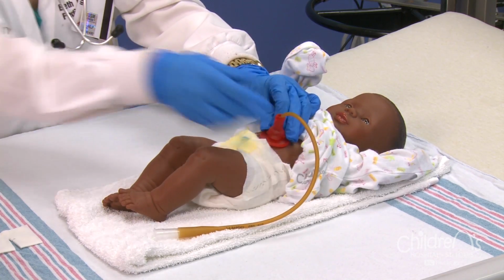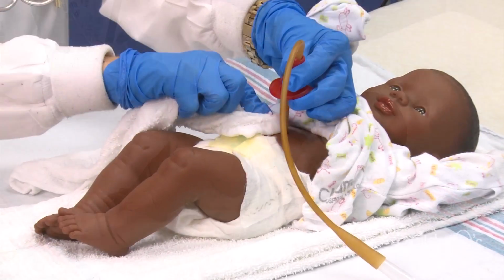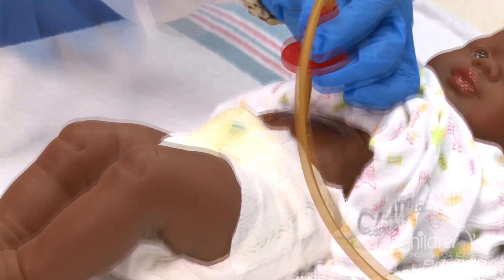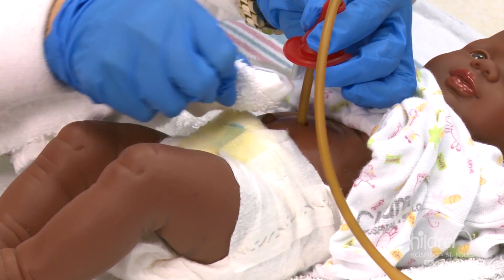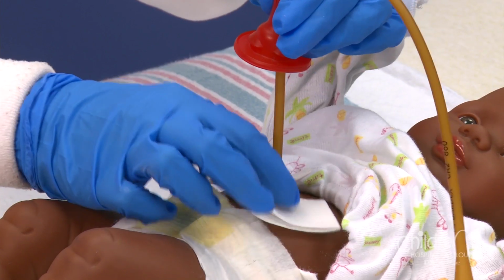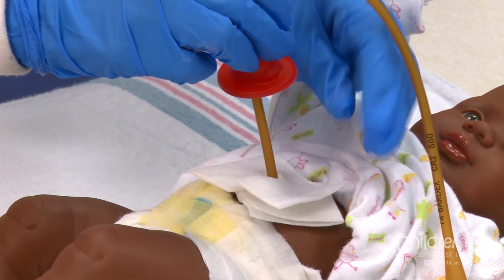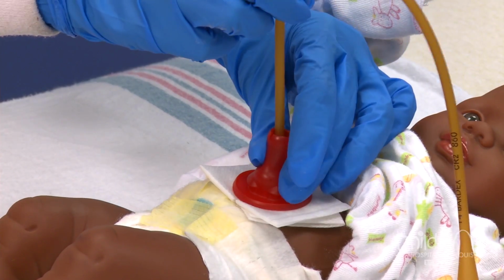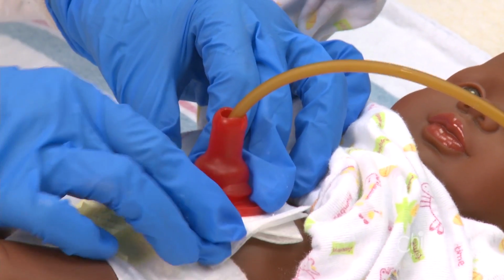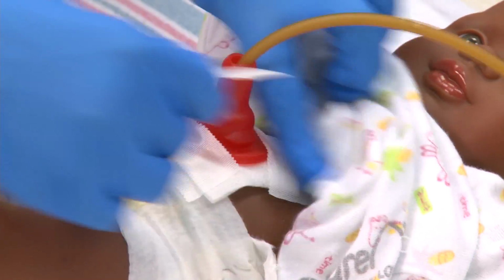Hold the tube straight up and gently lift up the nipple. Clean the skin around the tube with warm, soapy water. Rinse the area and pat it dry. Put a gauze pad under the red nipple with the split facing up, and then one under the nipple with the split facing down, the opposite direction. Hold the tube and gently push the nipple down on the gauze. Place 4 pieces of tape on the nipple and skin. This taping is called H-taping.